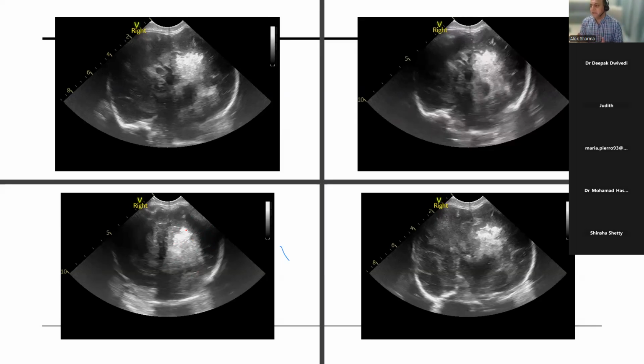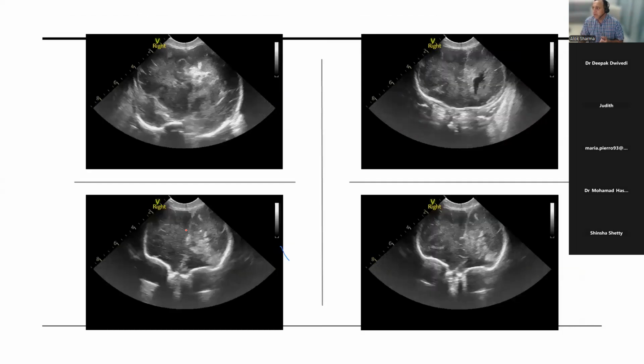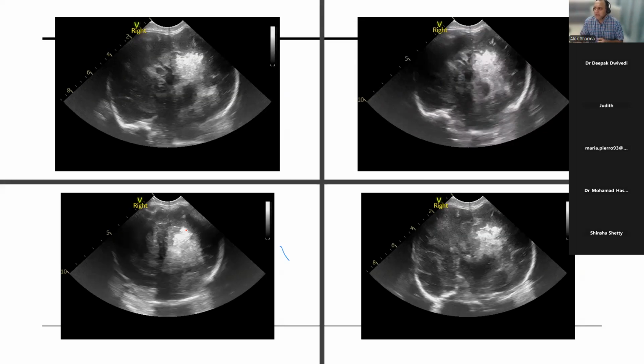The question from my perspective is, when I look at this, there are two very obvious things. There's cerebral edema and there is a focal hemorrhagic infarct in a baby who's got positive CSF. From my perspective, this really fits with a parenchymal injury that's quite severe. And I've got necrosis as well. So for a baby at 2 days having this kind of pattern, when do you think the insult has happened? Antenatal. Yeah, it's happened antenatally, in utero. MRI will give us much more information.